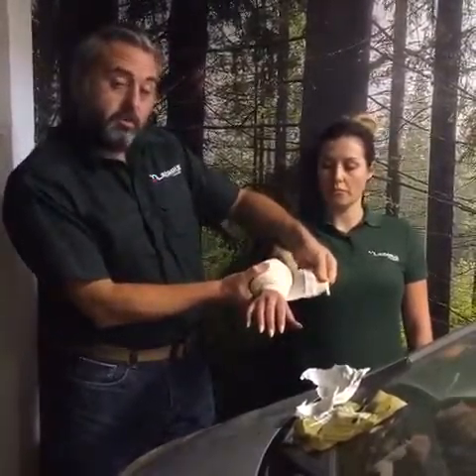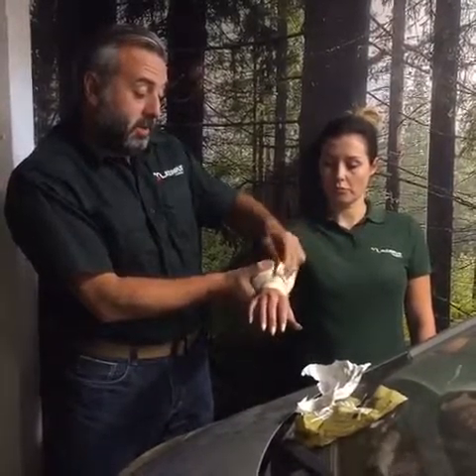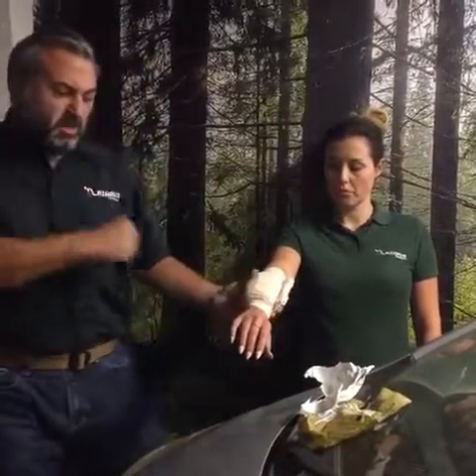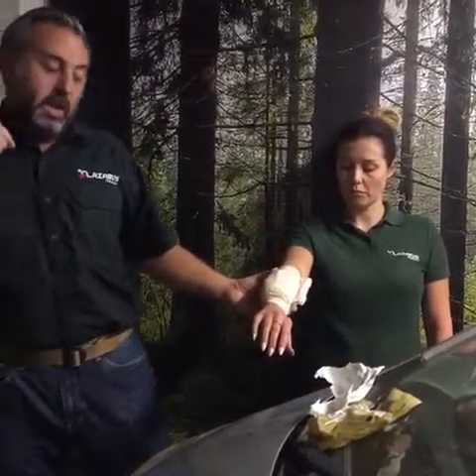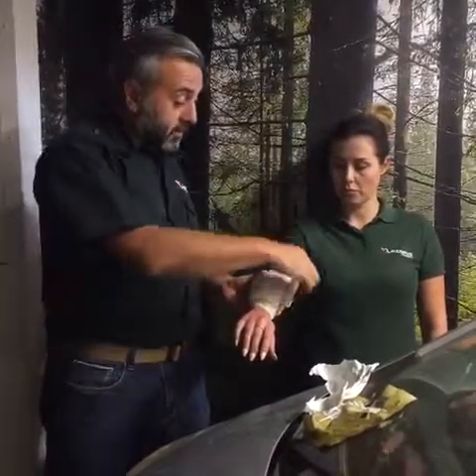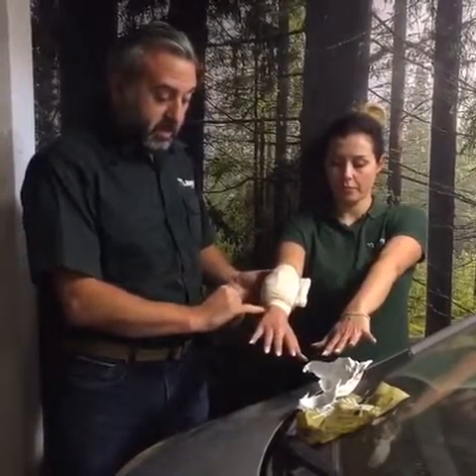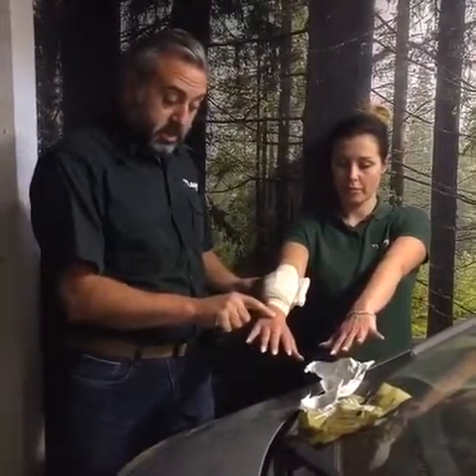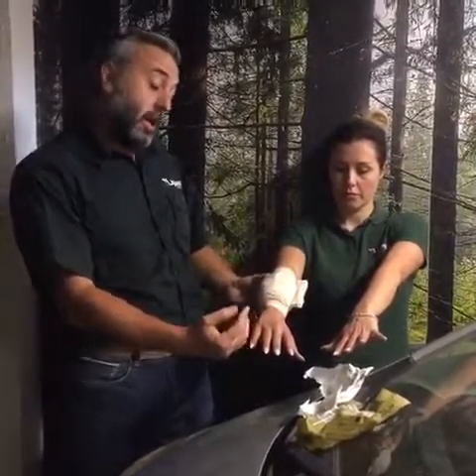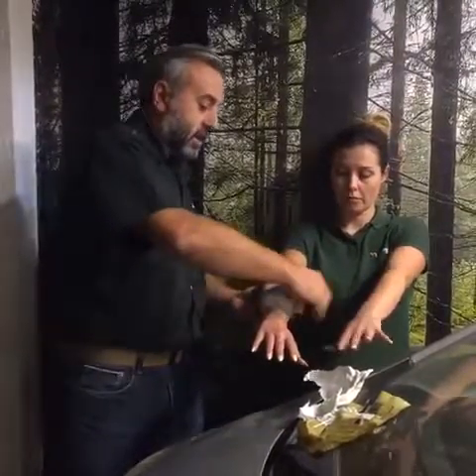Velcro, or hook and loop, is coming out with more and more first aid equipment, and here we see a nice, easy application of it — a fairly tight bandage. I wasn't pulling on it really, really hard. It's elasticated so it recoils a little bit, and you get nice, firm pressure. You just stick your other hand up so we can see the two — we can see there's still blood flow into this area. If done a bit tighter, you start to see the blood vessels coming up, meaning there's blood flow in, so it's not a tourniquet — it's just slowing flow out.